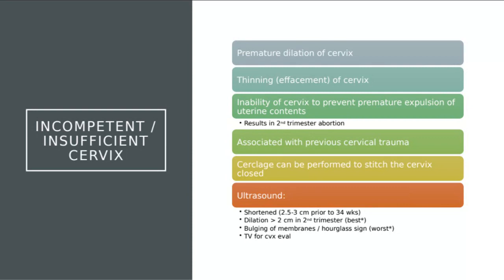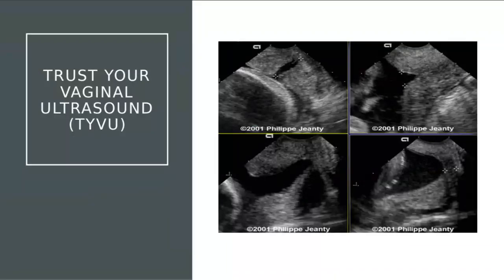Again, if we're seeing anything abnormal, we are requesting to perform a transvag. We are not going and performing a transvag. We are requesting to perform it. We're bringing it to our radiologist, we're bringing it to our physician, and we're saying, hey, this is what their cervix looks like. Would you like me to do a transvaginal? And they can weigh those options.